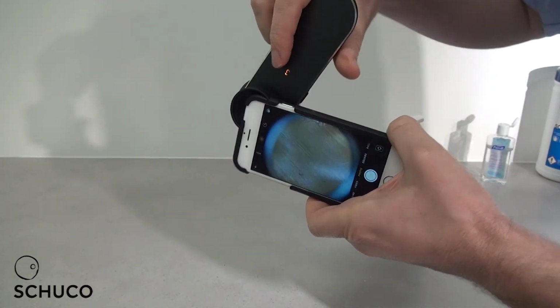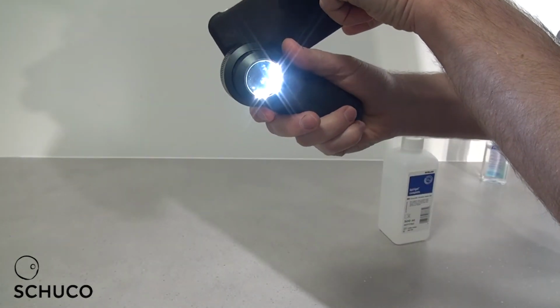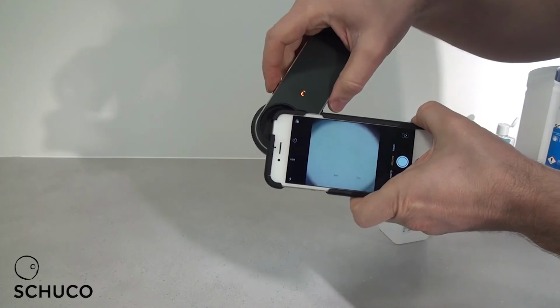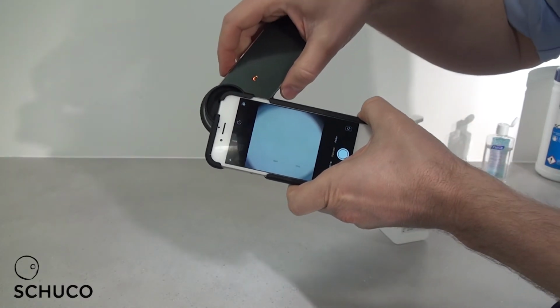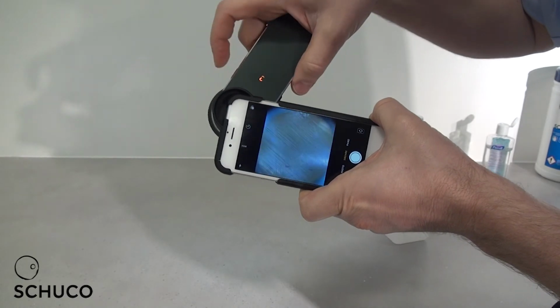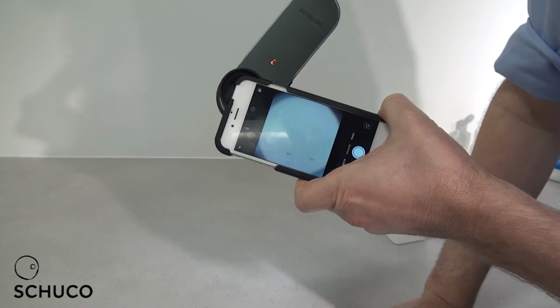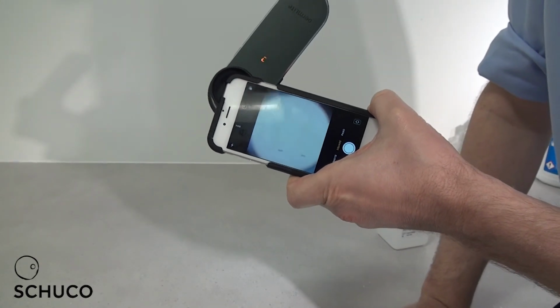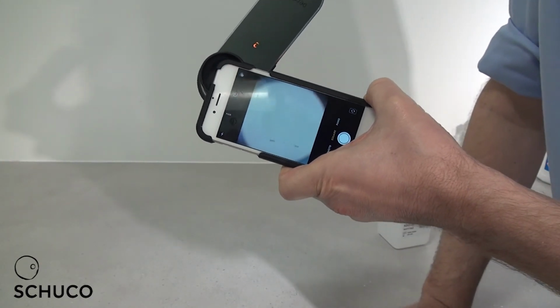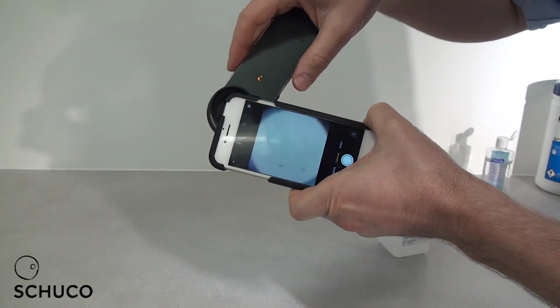You can also include a polarizing image at the same time by just pressing the button again, flicking between the non-polarizing and the polarizing setting just by pressing that button, and you can have two sets of images. You can leave the dermatoscope exactly in the same position and just press the button and take two different images. It is important to make sure that you have a non-polarizing image first, and then if you want to additionally add a polarizing image as well, that can also be useful.